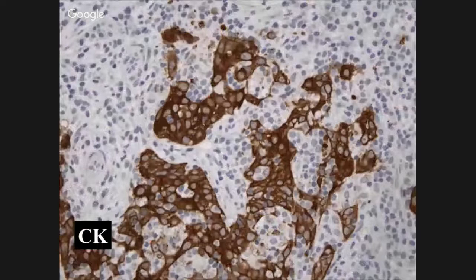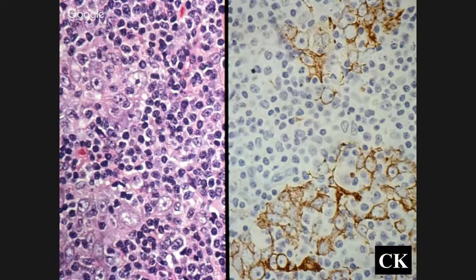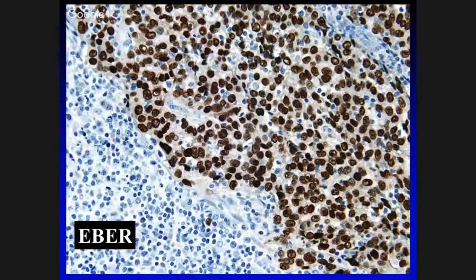The keratin stain is extremely helpful. In a patient with metastatic cancer of no known primary, in which you get a biopsy that looks like mixed inflammation, where's the cancer? It's all these histiocytic looking cells in here that, if you didn't think about it, you'd just say mixed chronic inflammation. If you don't do the keratin, you miss the diagnosis. You do the keratin, you get this reticulated pattern, and these are EBV positive.